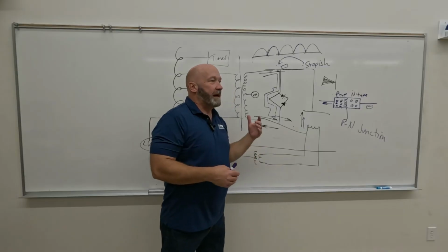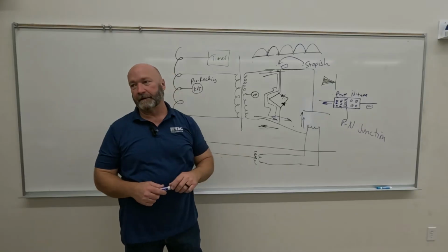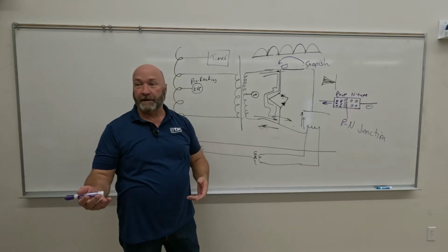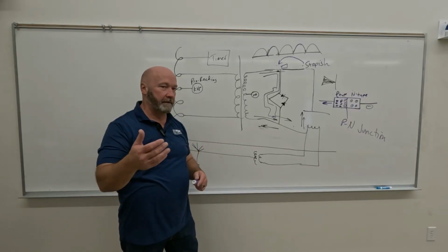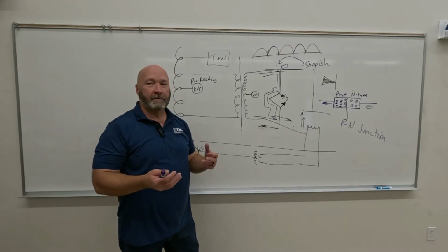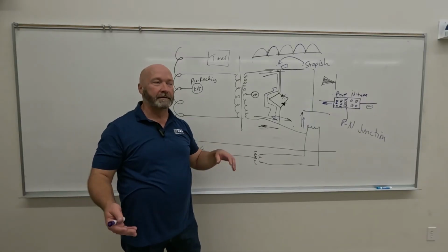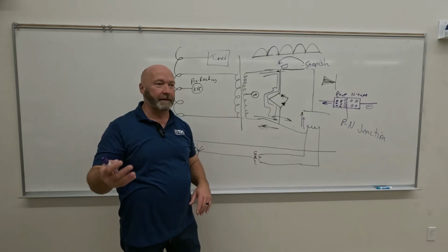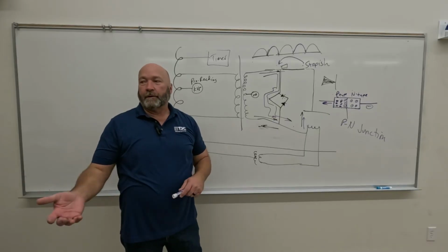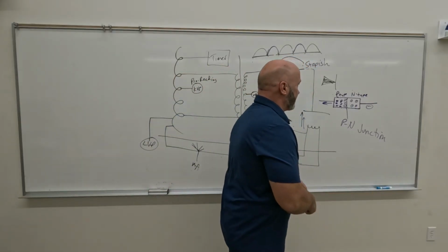We can't use that on most older machines. I don't even know if they make single phase machines anymore. We still have to cover it. They used to be cheaper than buying modern machines, but I think it's gotten to the point of diminishing returns where it probably costs more money to make single phase than it's worth. They just can't sell them cheap enough anymore. So I question whether you can buy a single phase, still have to cover it, but I question whether even a doctor's office can buy it.